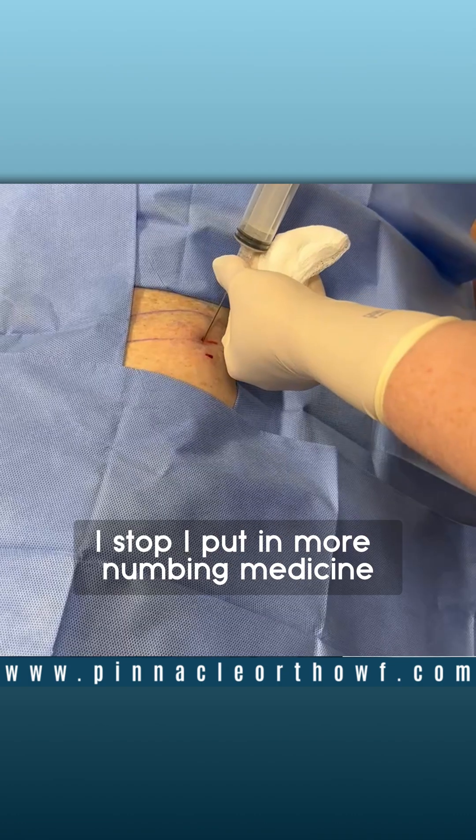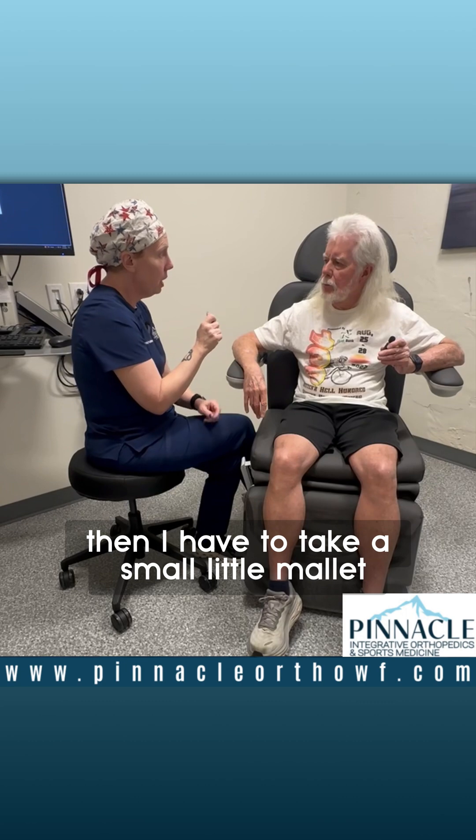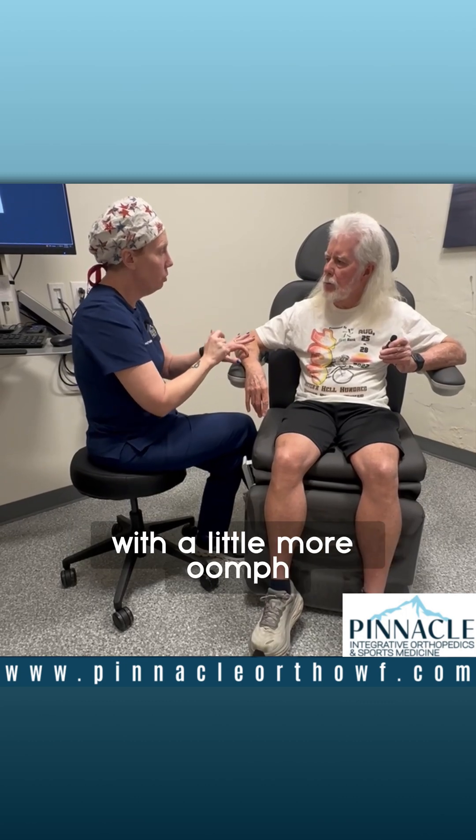But if you feel pain, you tell me. I stop. I put in more numbing medicine. Then I have to take a small little mallet, and I have to tap it in with a little more oomph.